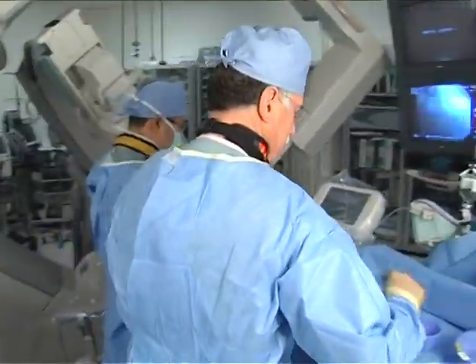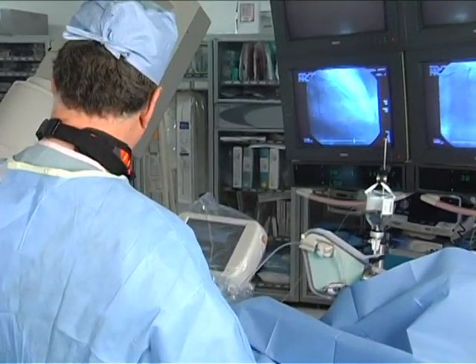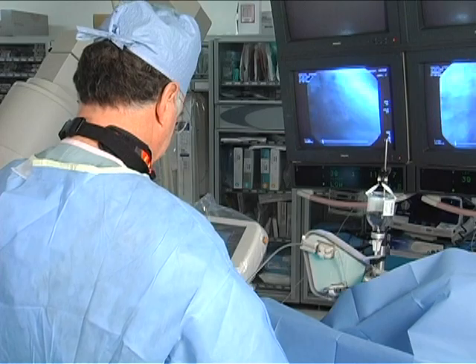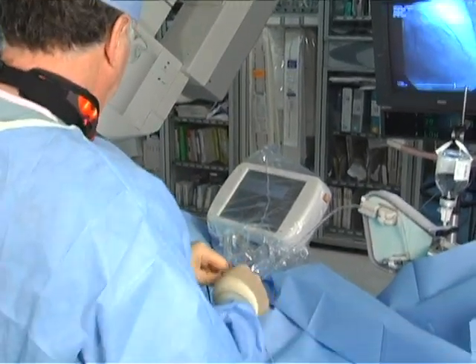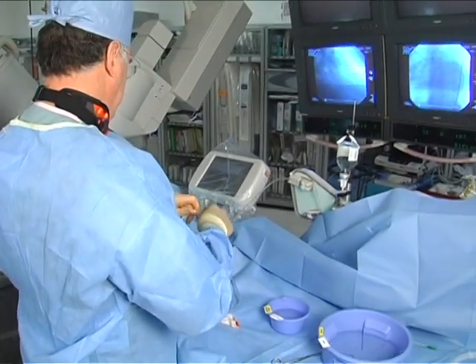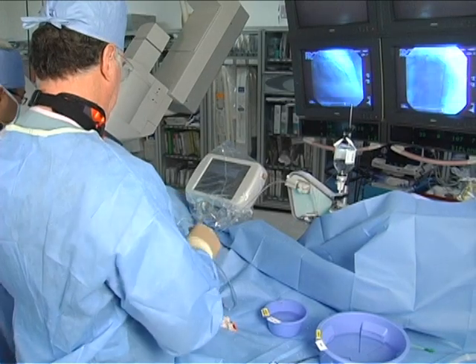Let's take that catheter out, straight out, and we'll put up the right Judkins. We're just going to do a straight pull. And there's a flush there for you. So we're going to go back now with the next catheter, coil that up. Thank you. Okay, here we go.